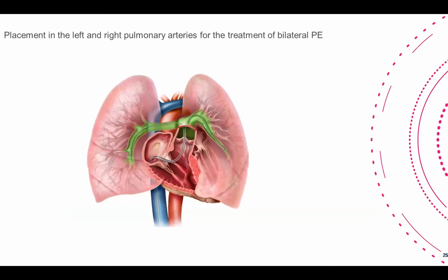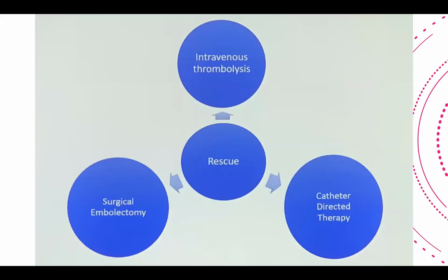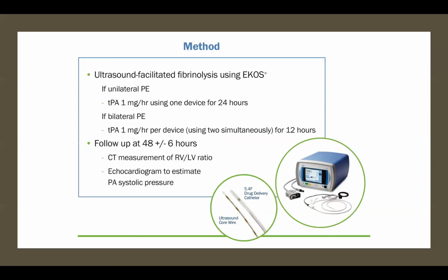So what we do, we choose venous access either through the jugular or femoral vein, and then we'll go through the IVC or SVC, and then through the heart, we'll put in a catheter into the right and the left pulmonary artery, and then we'll start treatment. Treatment either by thrombolysis or thrombectomy. I'll talk about this soon. So this is the machine that we use for thrombolysis. It comes with a generator and has an ultrasound wire, and also it has a catheter itself.